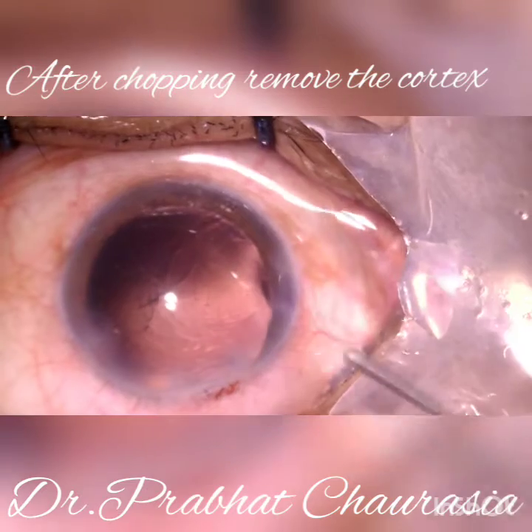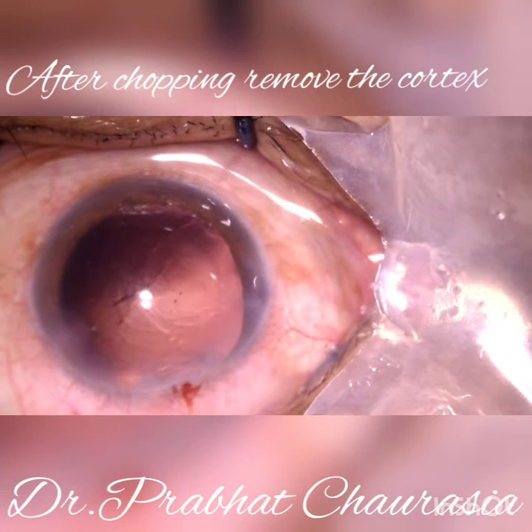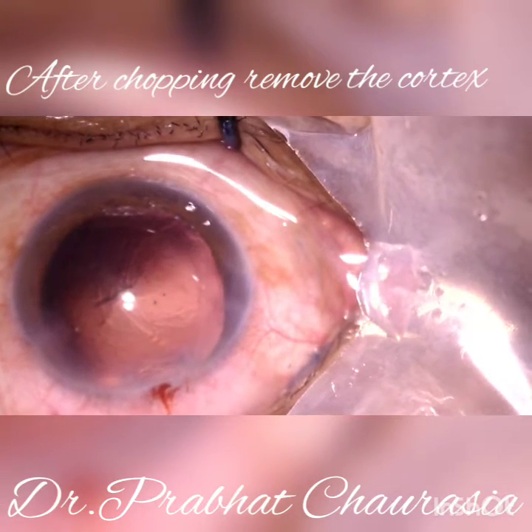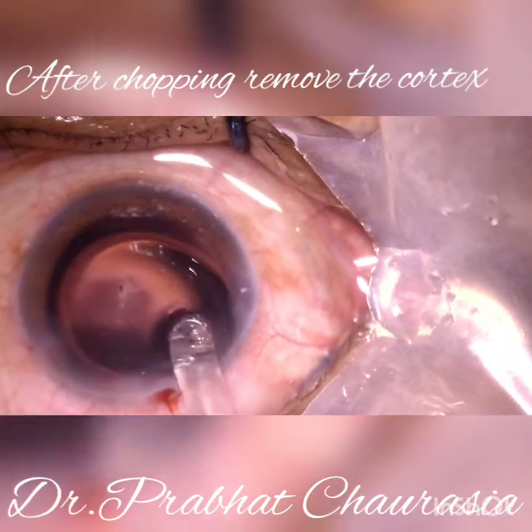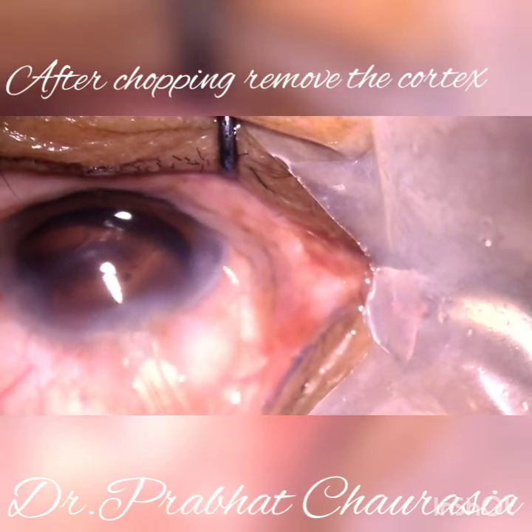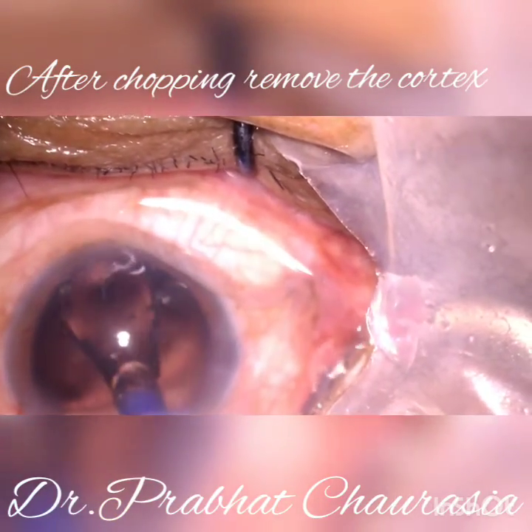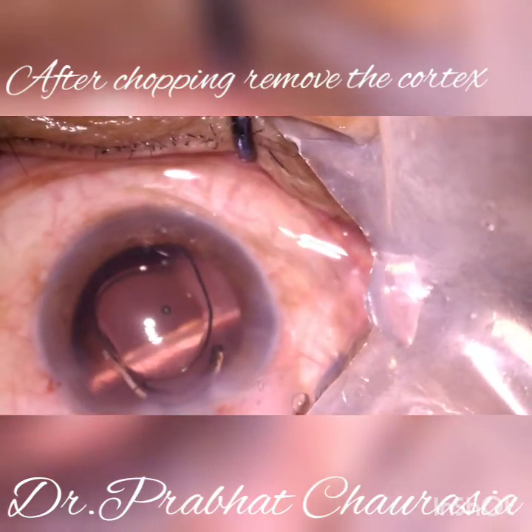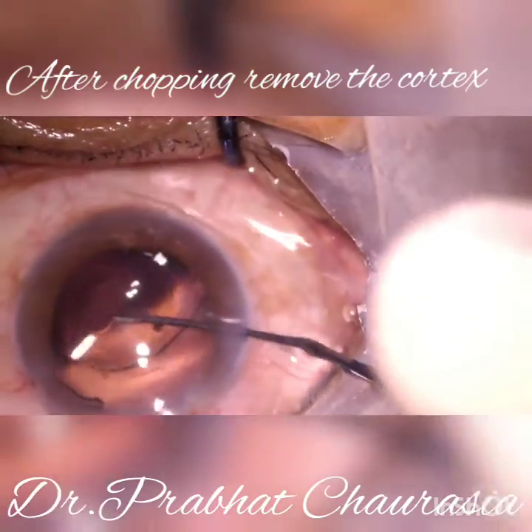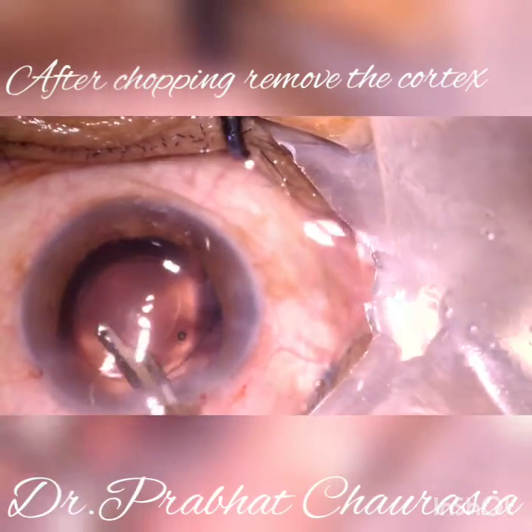Inject some HPMC and then implant the intraocular lens. First, inject the leading haptics of the lens into the bag, and then with the help of a lens dialer, rotate the trailing haptics into the bag and make sure it is properly seated.